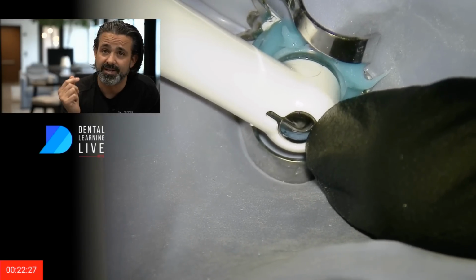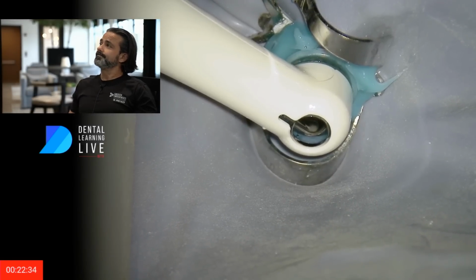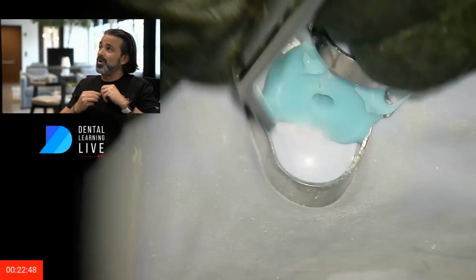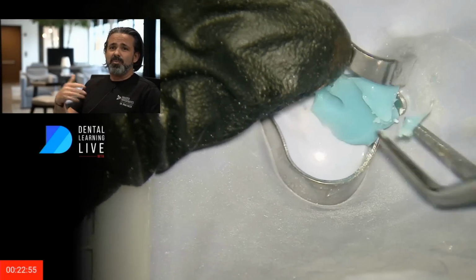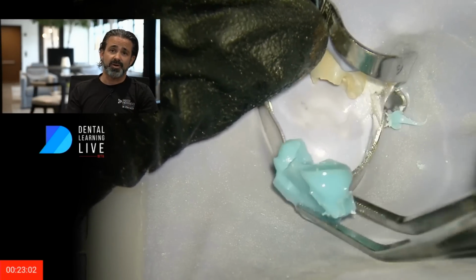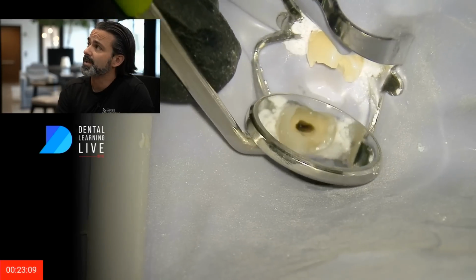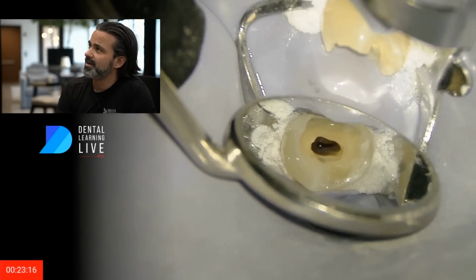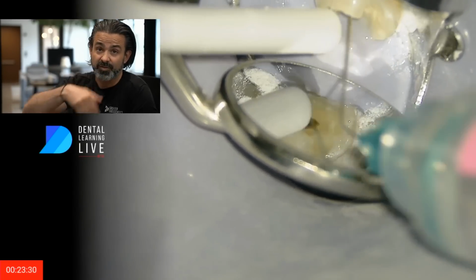And if you look, we're 22 minutes now into this case. When you watch the windows, I really pay attention to what comes out. I find that quite fascinating. I'm always looking for puffs of maybe blood or pus or whatever the scenario may be, and this is no different. So I hold the handpiece, and I pay attention to that. I make sure that bubble's dancing the whole time. You saw me remove the sound seal, and now I'm looking in there and noticing some bleeding coming out of that, which is good. And the theory is the fluid dynamics now took me to the end.